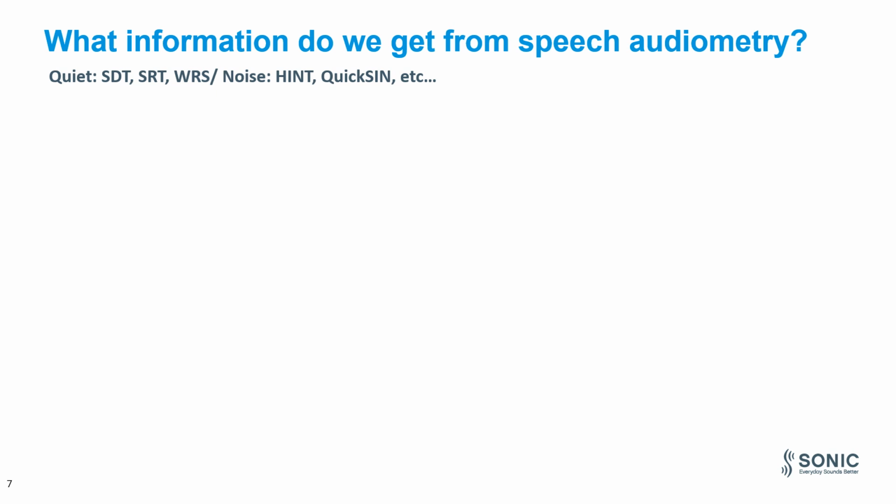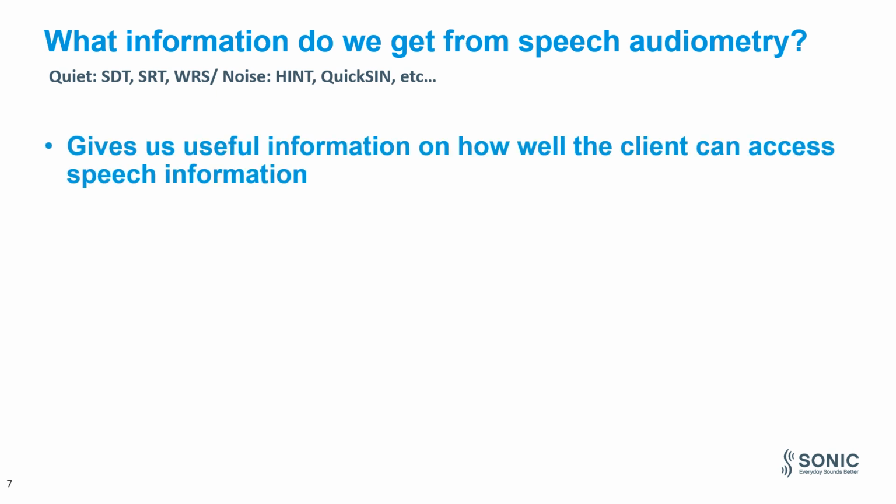So what information do we get from these tests? First, it gives us plenty of useful information on how well your client can hear and access speech information and not just tones. It helps us to know if our client with hearing loss can still recognize or discriminate speech before fitting them with amplification.